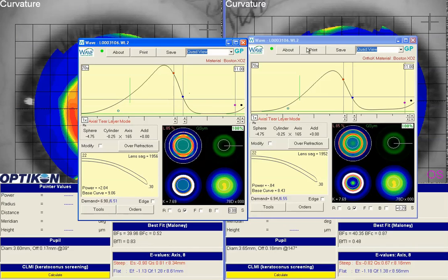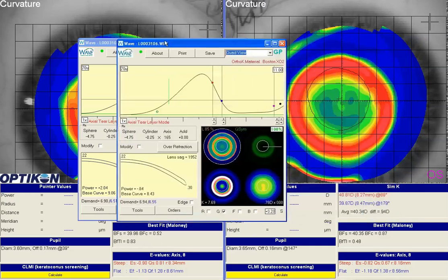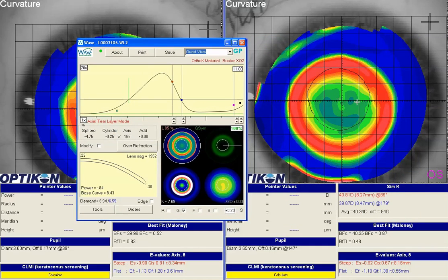And so hopefully this will give us a little bit more room in the treatment zone of the lens and give the patient a little bit more relief from nighttime glare and halos. As far as positioning of the lens, it is possible to decrease the sagittal depth even more to see if we can get this lens to settle a little bit higher.